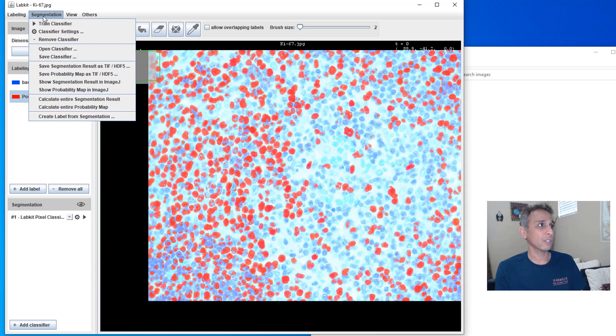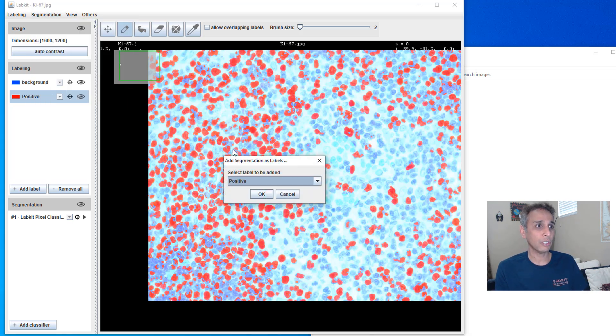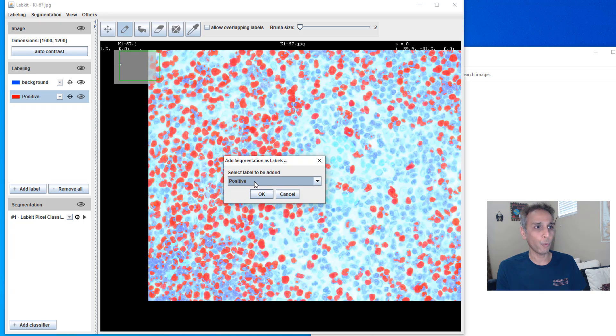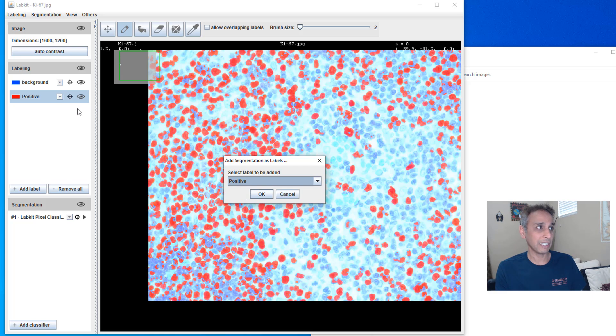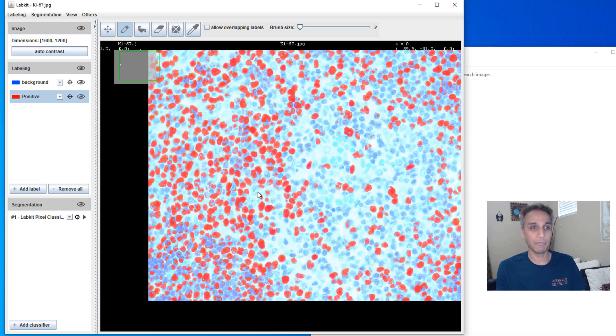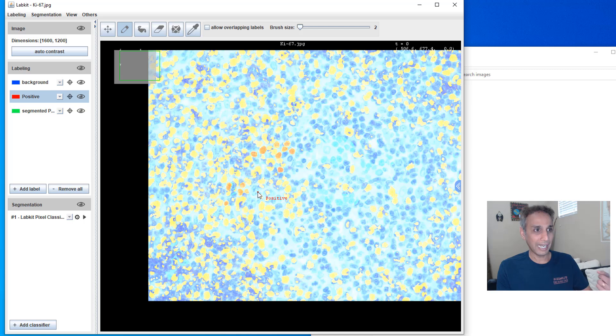So you just go to segmentation, create a label from segmentation. So it's going to create a label. And for which class do I want to create? Obviously, not for background, but for positive, this class, the brown nuclei class.